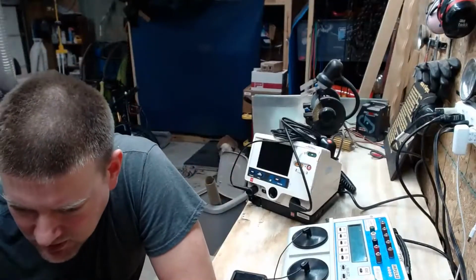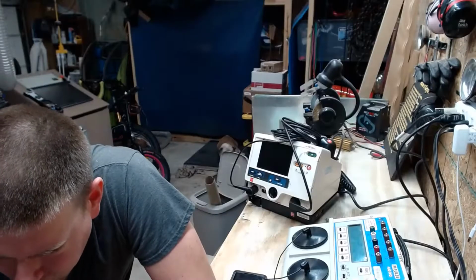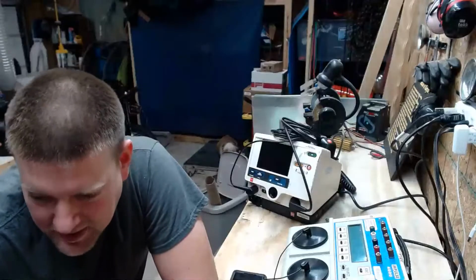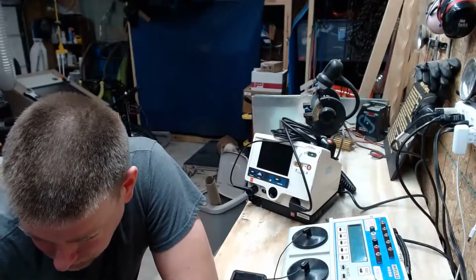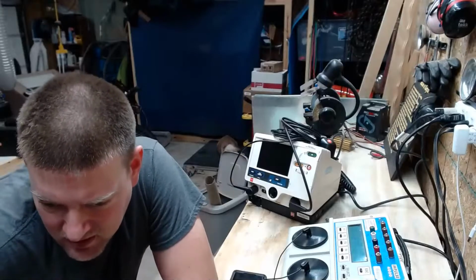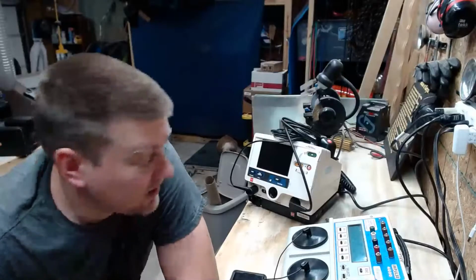Anyway, let's see. What else can I read here? The LifePak 12 goes at 360 joules. I'm actually very surprised about that. You're absolutely correct. That is a hell of a lot of energy, guys. 360 joules biphasic. Dennis, you are absolutely correct.